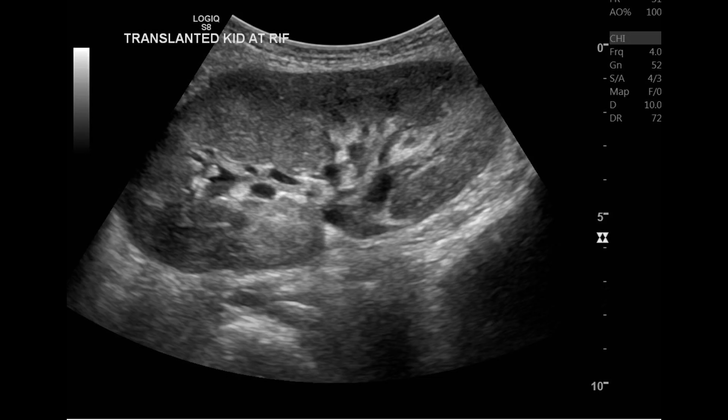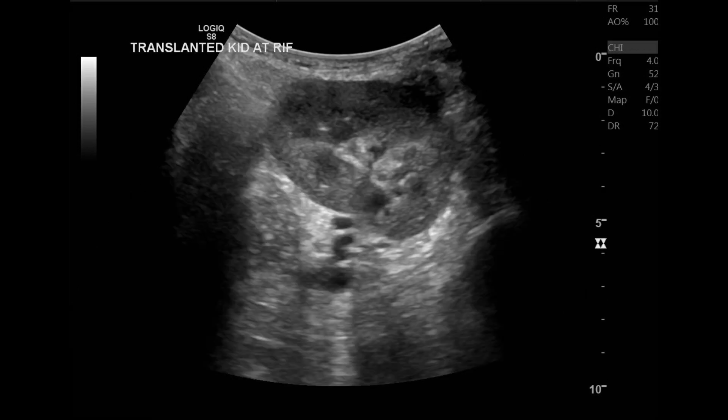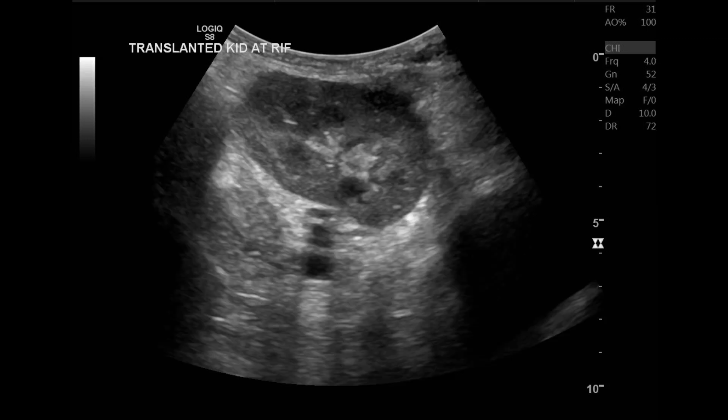We start our scan with the grayscale image, as we do with the native kidney, on the sagittal and transverse views. We will look for any abnormality, assess the parenchymal echogenicity, and make sure there is no hydronephrosis. We also assess the perigraft region to make sure there is no hematoma or any collection.